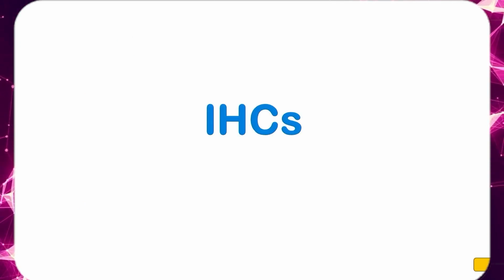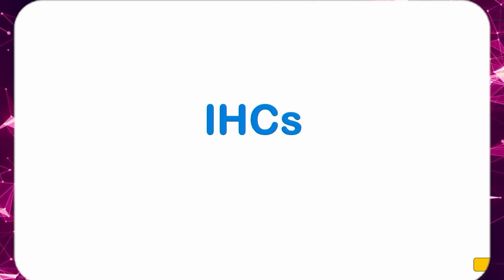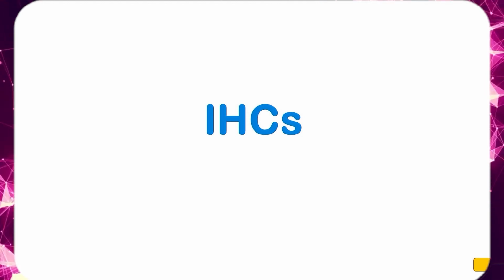You can ask me 50 immunostains and I'll give you the answer. Anyone. Let's have that fun. Vimentin is not a good stain. I don't even consider it an immunostain. Anything else?